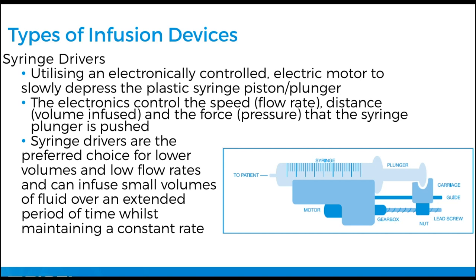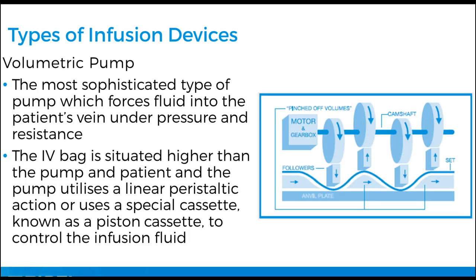Syringe drivers utilize an electronically controlled electric motor to slowly depress a plastic syringe piston plunger. The electronics control the speed, which is the flow rate, the distance, which is the volume infused, and the force, which is the pressure of the syringe and the plunger being pushed. Syringe drivers are the preferred choice for low volumes and lower flow rates, and can infuse small volumes of fluid over extended periods of time whilst maintaining a constant rate.